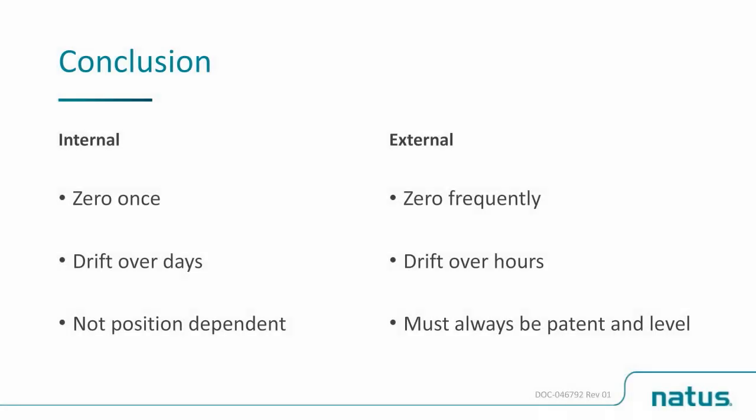In conclusion, there are distinct differences between internal and external transducing. Nursing management of an internal transducer will consist mostly of ensuring that the catheter stays in place throughout the course of treatment. An external transducer's accuracy is critically dependent on the nurse management, keeping the drain leveled consistently and zeroing frequently. It is good practice to re-zero the external transducer before treating an elevated ICP, ensuring that the number you are treating is correct.